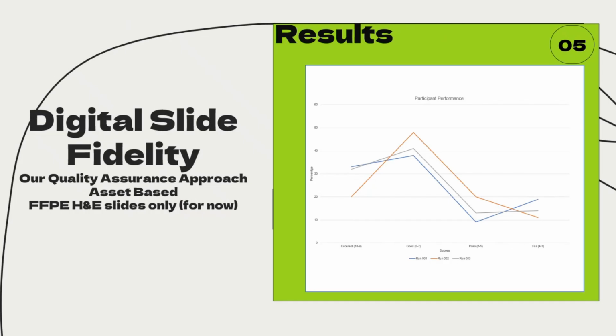I do have some examples of why people are failing, but it tends to be because the entire piece of tissue that's on the slide is not on the image, say it's not within the scanning area. We're not a diagnostic scheme. So say you submit a piece of bowel that has a lot of fat around it and the fat is not in the image, we will still fail that because we expect everything that's on the slide to be on the image.